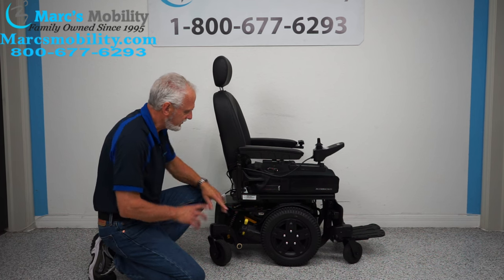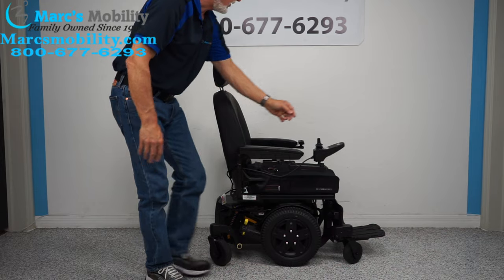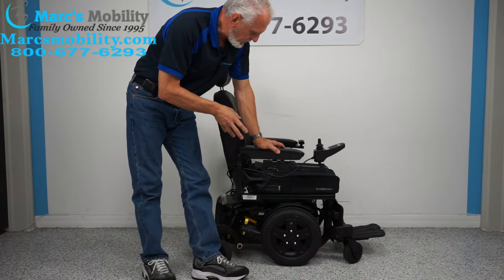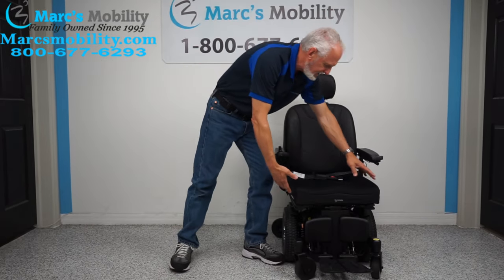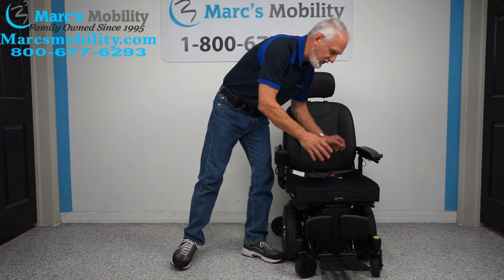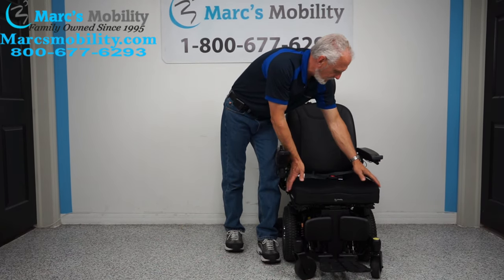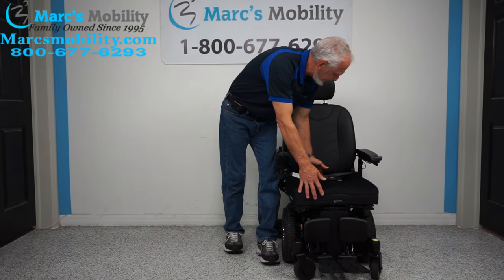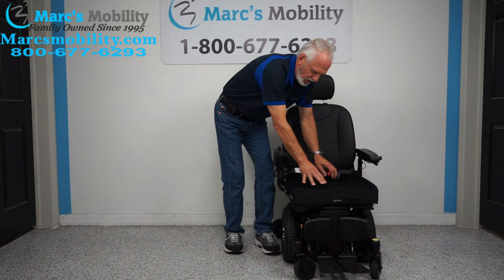So that's how you put it in neutral with the motors on both sides with the power off. I'm going to turn the power back on. So this chair, as I said, it's a Quantum S3 Stretto. It has a seat on here of 19 inches wide by 21 inches deep — it's set up for a fairly tall person.